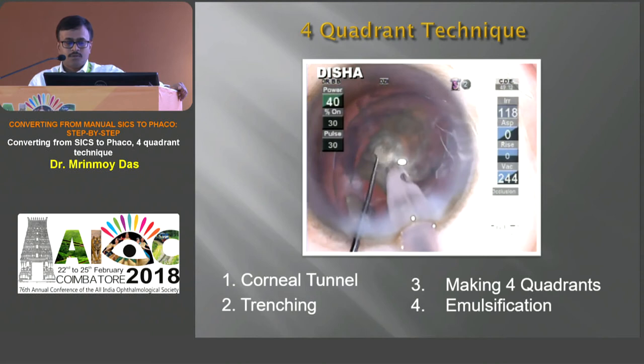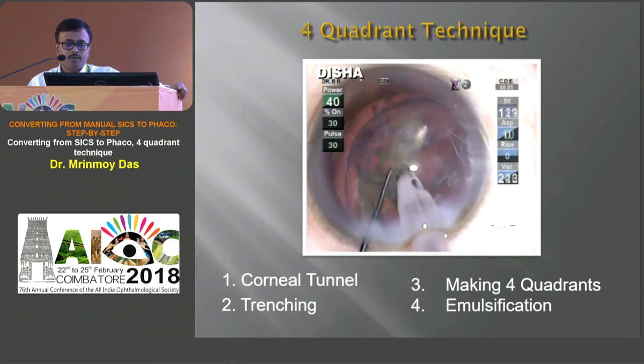After that you can take out the epinucleus in epinuclear mode very easily.